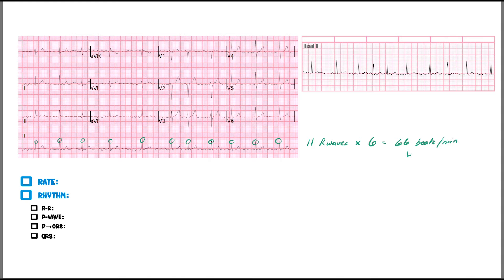One thing you really want to remember: this is the ventricular rate. This can sometimes confuse people who assume it's the atrial rate — no, this is the ventricular rate because we're tracking off the R waves. If I wanted to determine the atrial rate, I'd have to measure from P wave to P wave. So we have a ventricular rate of about 66 beats per minute.